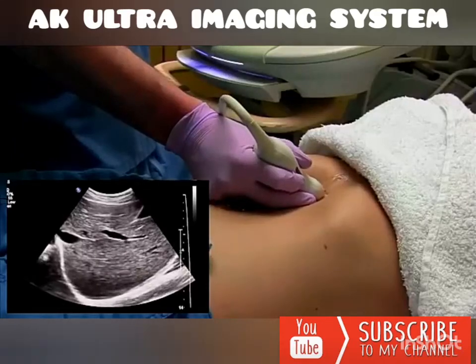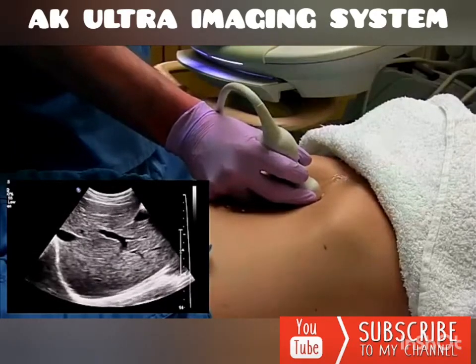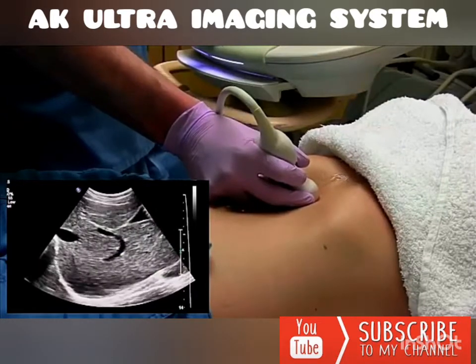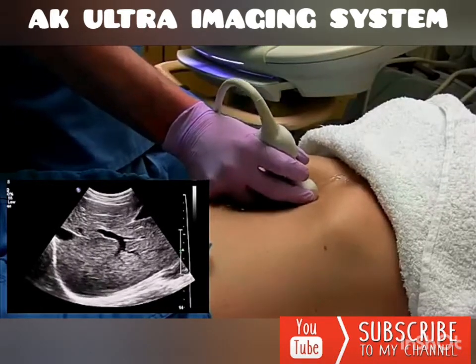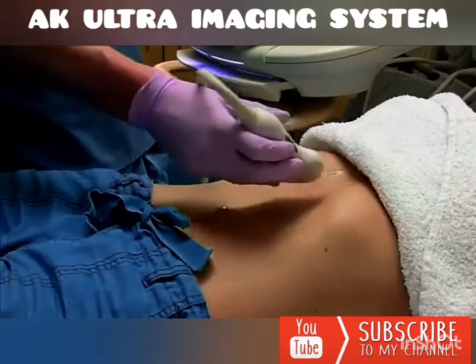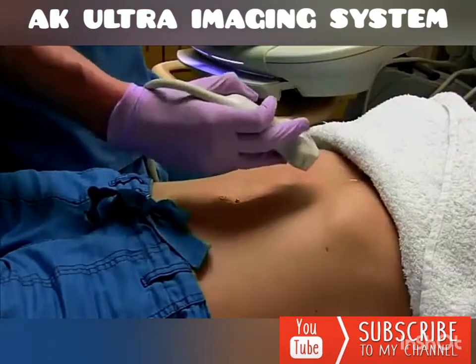The right lobe. The third picture of the right lobe you're going to take with the portal veins. If you were looking for any ductal dilatation, this is where you would see that, at the level of the portal system. And from there you just sweep all the way out of the liver. So that's the sagittal sweep through the liver.